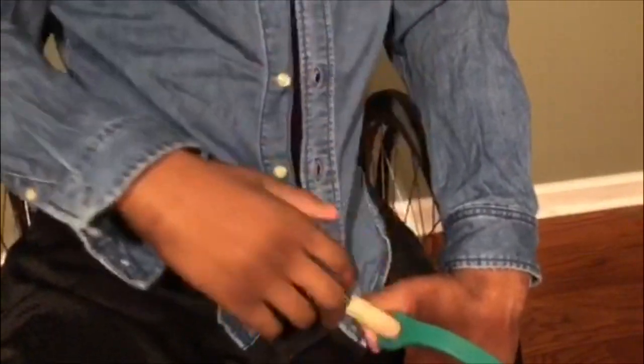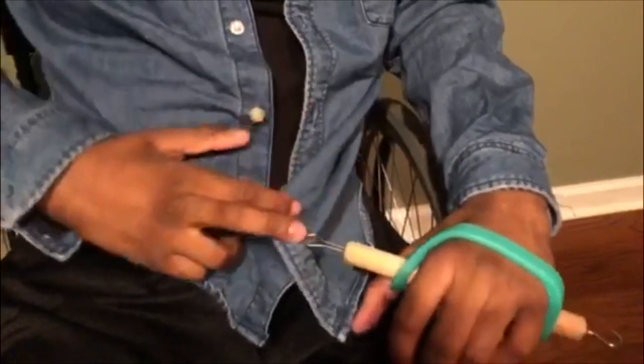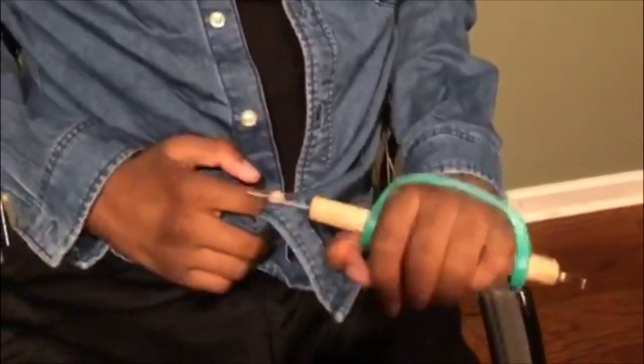You're going to want to keep it straight, then you're going to want to pull it all the way through. Perfect — that's one button down.